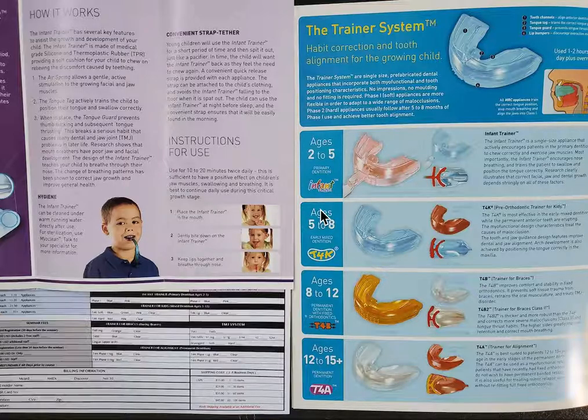Okay. So good news about the MRC appliances is that they are low cost. Bad news is that their durability is really poor. So be prepared to replace them several times. And I don't think that you get a refund on chew-throughs or bite-throughs. So just keep that in mind. So price point for the trainers, as far as I see for US dollars, is about $60, if you're ordering less than 10 at a time.